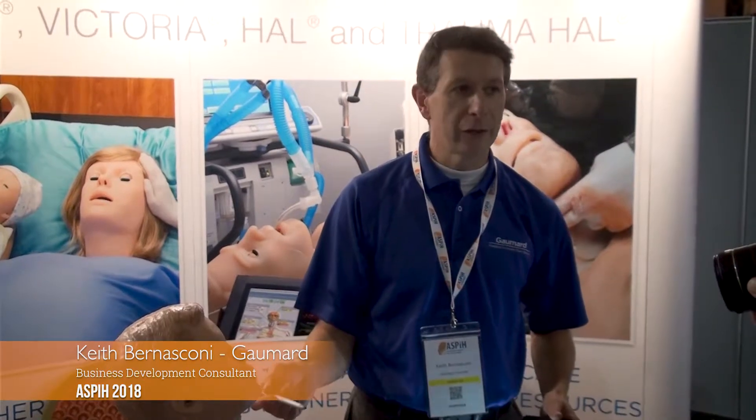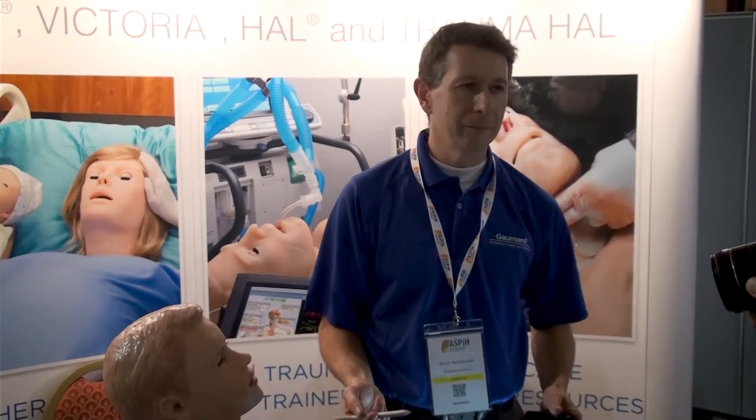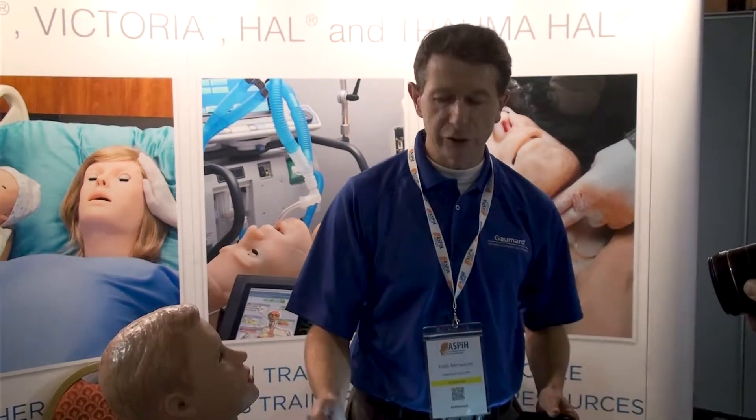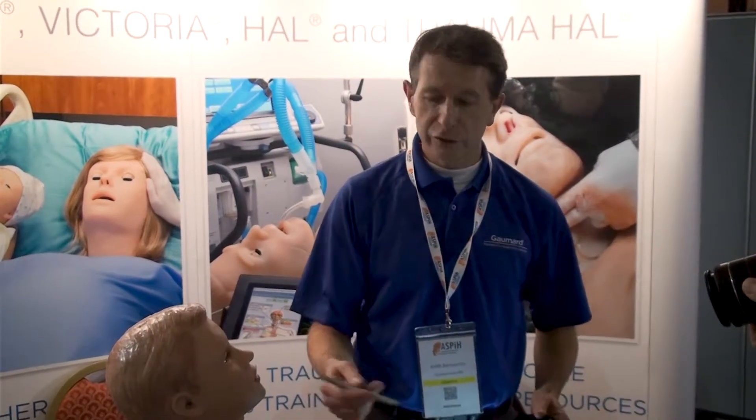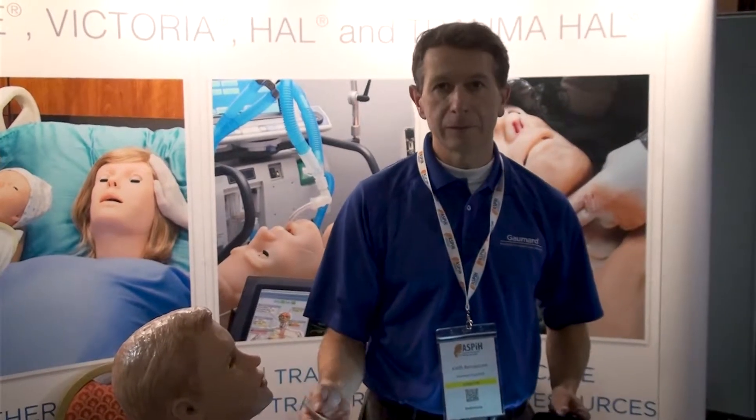This is our paediatric S2225, our latest paediatric mannequin, and this is the first time it's been shown in the UK. All the two have been purchased. It's a high fidelity mannequin with a paediatric assistant.